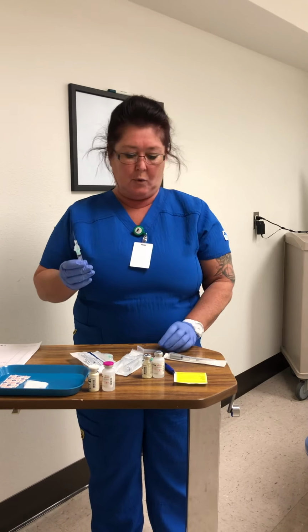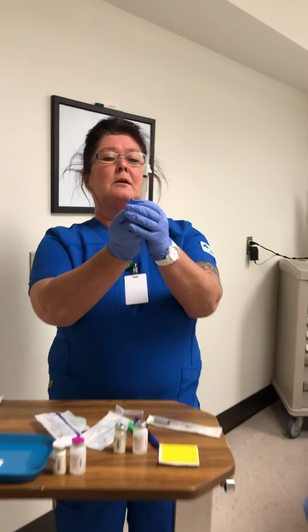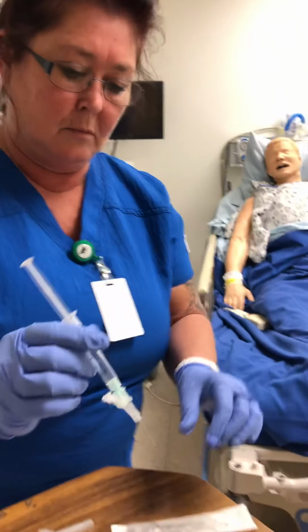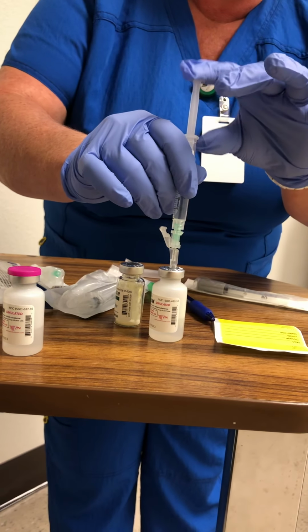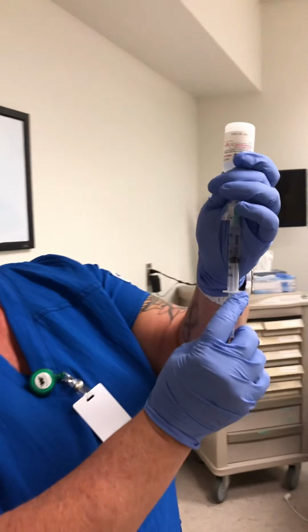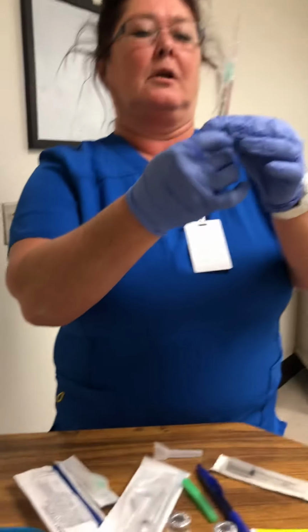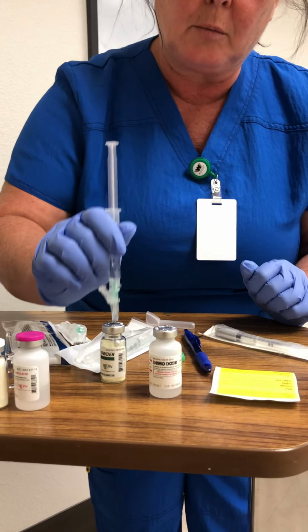Okay, and then I'm going to mix 3 mils of water into the powder. So I want to draw back 3 mils of air. And I'm going to poke that straight in so the needle doesn't touch the water. We're going to push that in. And then I am going to tip, and I am going to draw back 3 mils of water, getting rid of any air bubbles. And we are going to mix this directly into the powder.